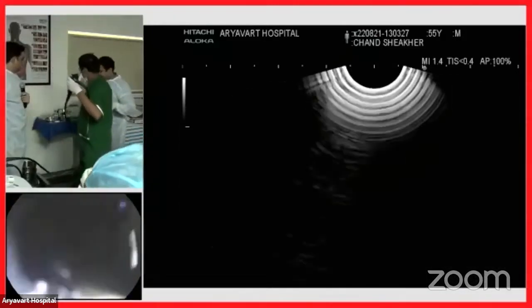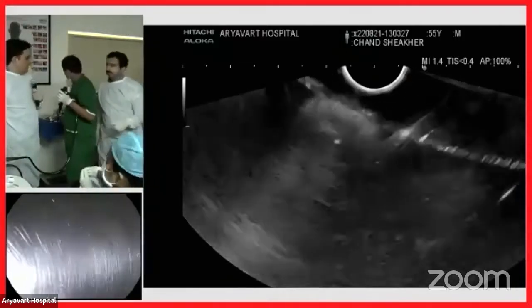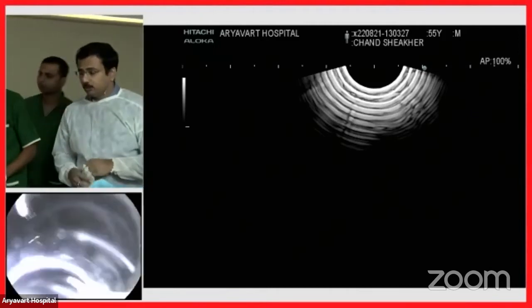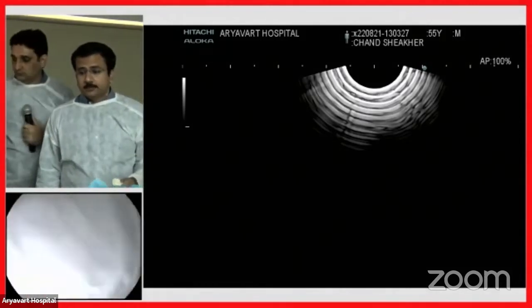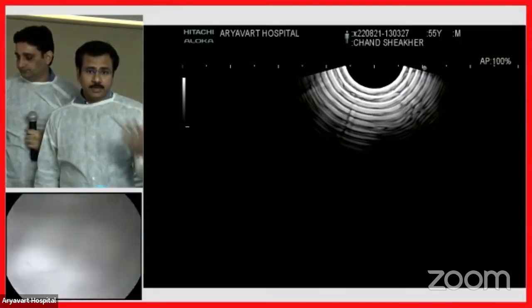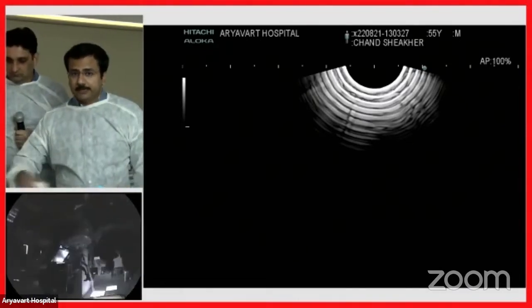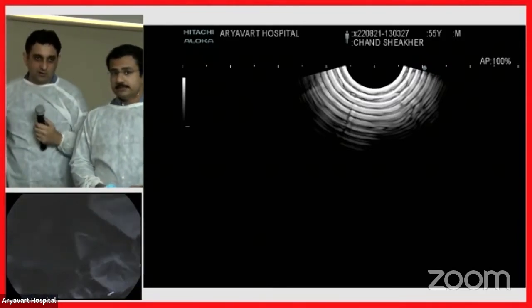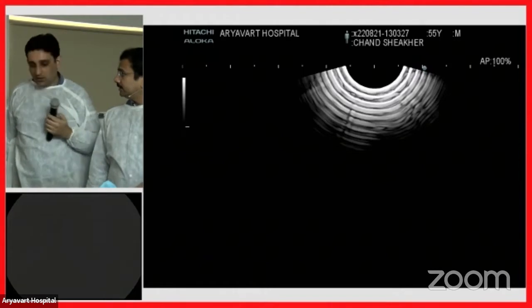We are done. We don't want to recheck it now. The data clearly suggests that endoscopic glue versus US-guided coil-plus-glue — we recently completed a multicenter study — shows that US-guided coil-plus-glue is definitely superior. Although the initial procedure cost is higher, the re-bleeding rates are much much lower, requiring far fewer repeat endoscopies, ultimately decreasing overall cost and decreasing the risk of re-bleeding.